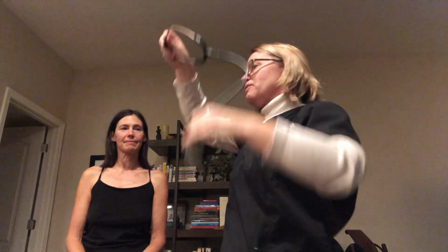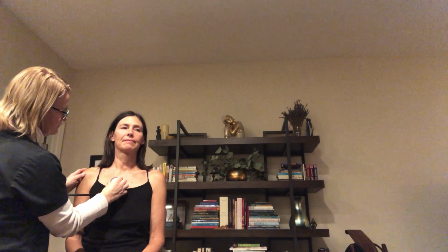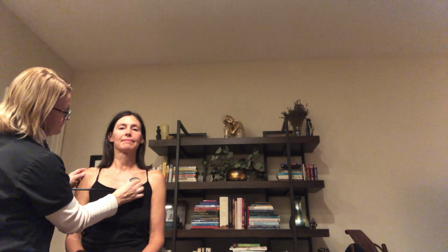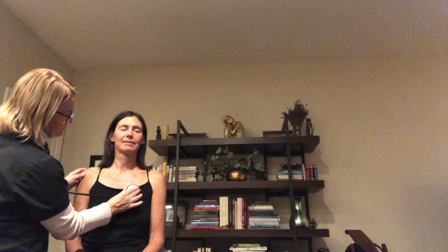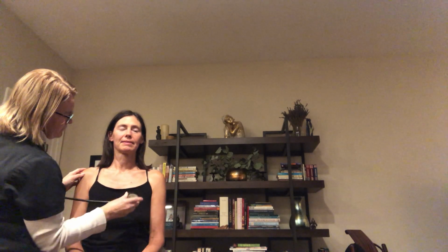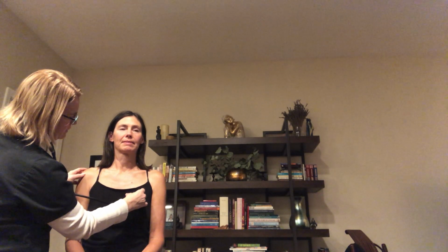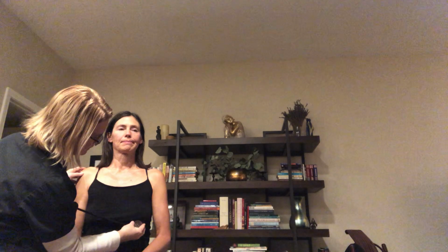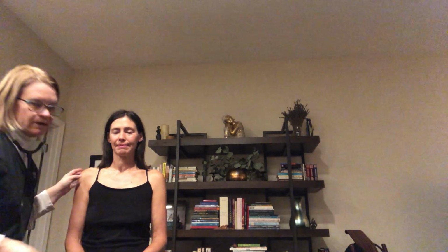And I'm going to listen now with the bell to see if I hear any murmurs. Actually, we don't need to do Erb's point because there's no valve there, but okay. All right, no heart murmurs.